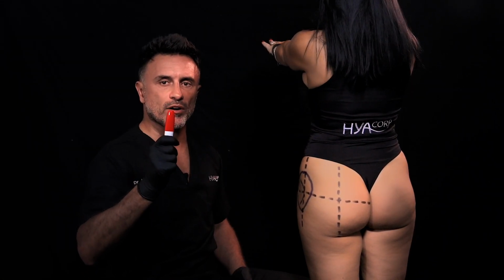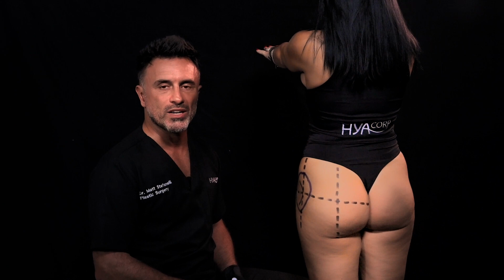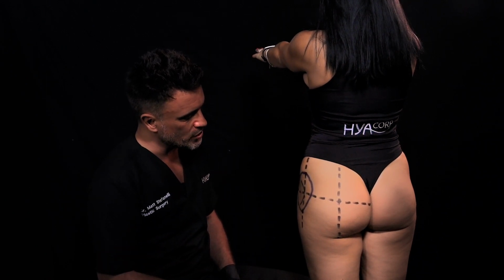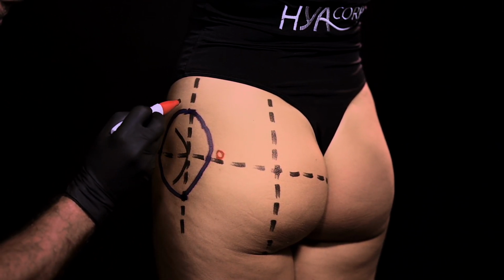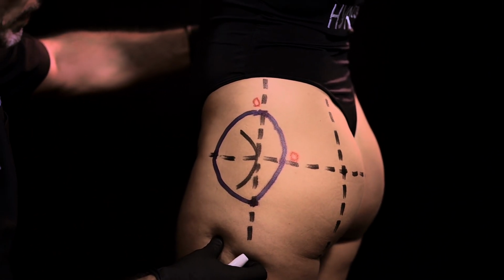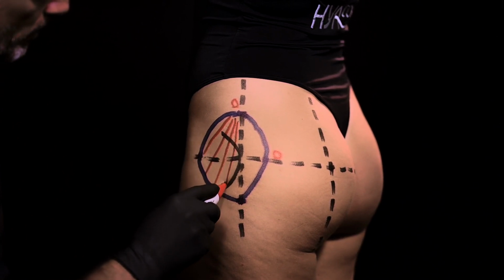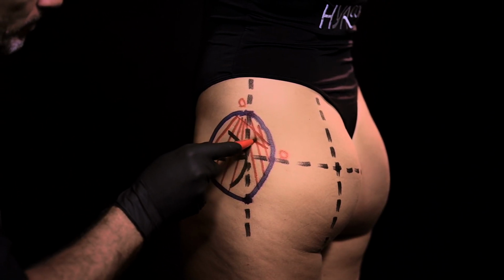Finally, I'm going to use a red marker now to place the entry point of the cannula, which will allow to inject HYAcorp MLF2. I like to always use two entry points to be able to crisscross my injection. One entry point will be here, posterior, and one entry point will be here, superior. This way, we can place our thread this way, and the other one will be perpendicular.